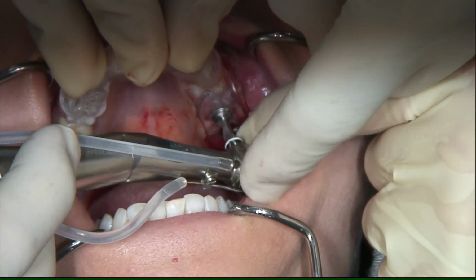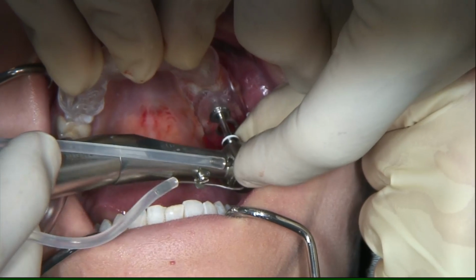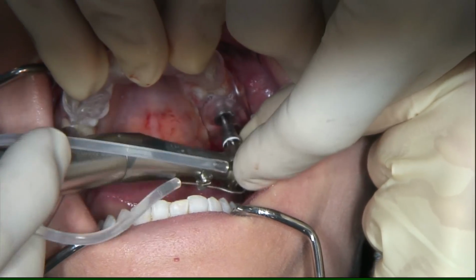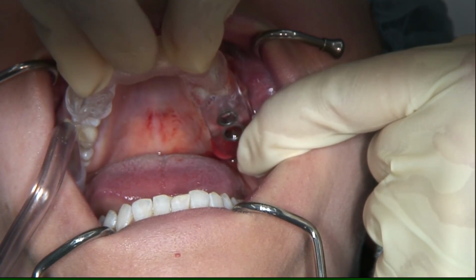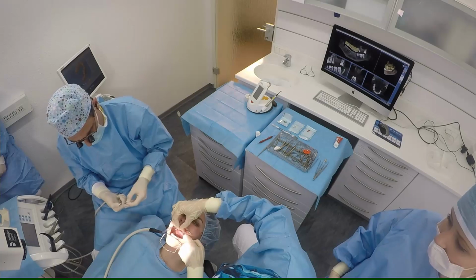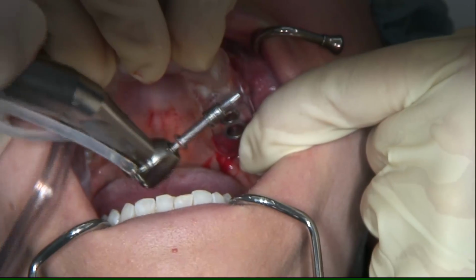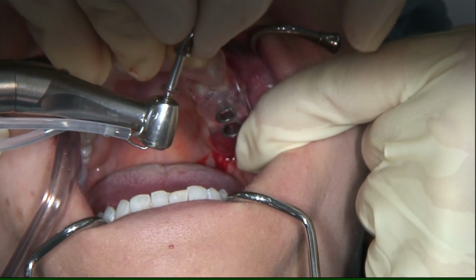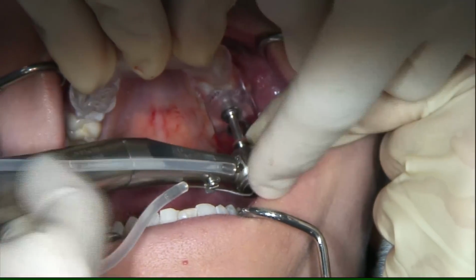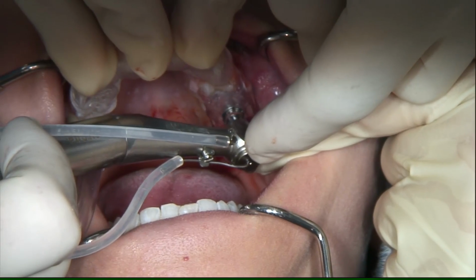So after the pilot drilling, we will change to expansion drilling. But this is still the pilot drilling with 2 millimeter diameter. This was length 11 millimeter. All this is guided through the sleeve-in-sleeve system. This makes it very easy, very fast, with reduced operation time, which leads to better wound healing. The shorter the operation time, the better is the wound healing.